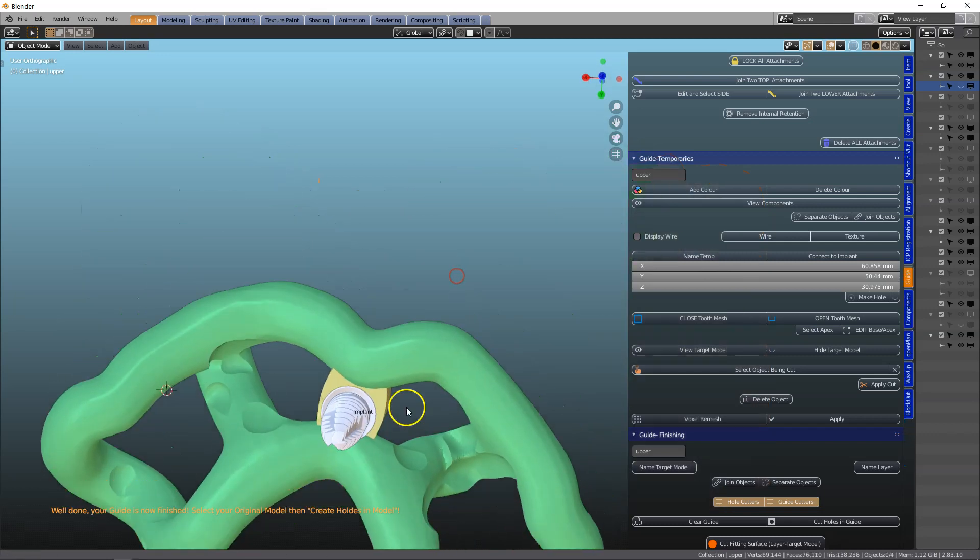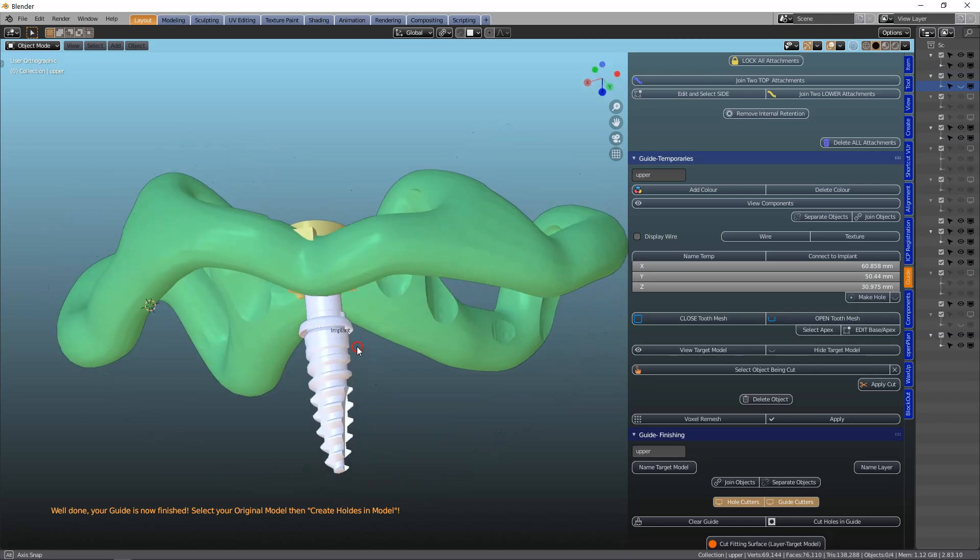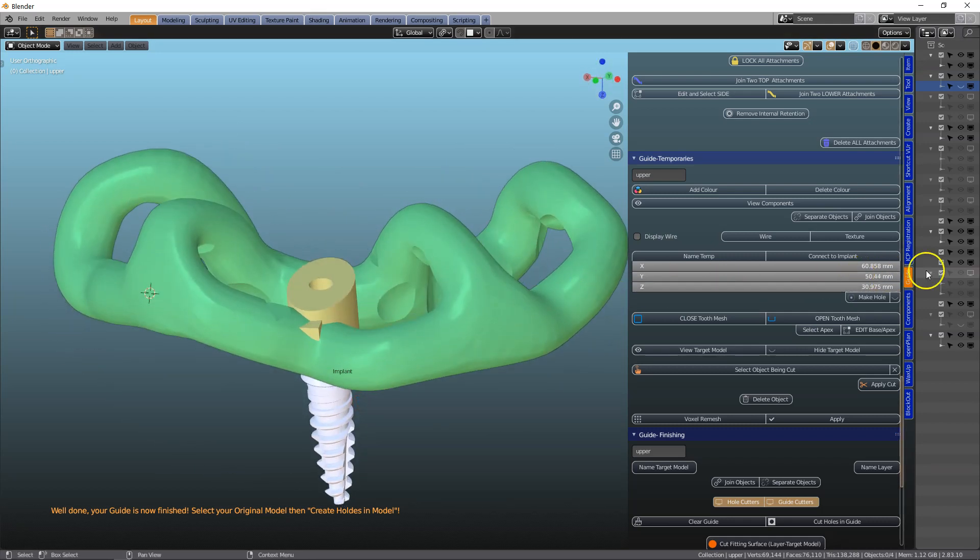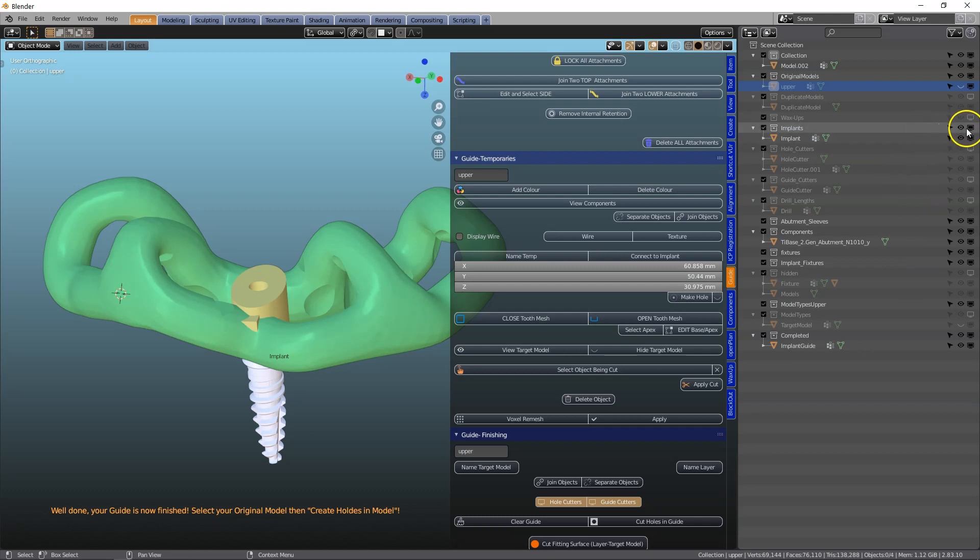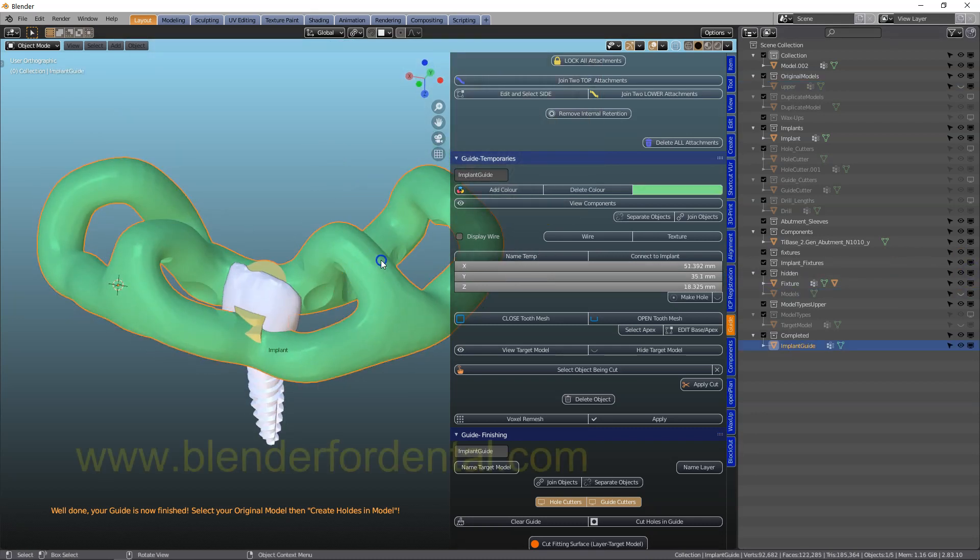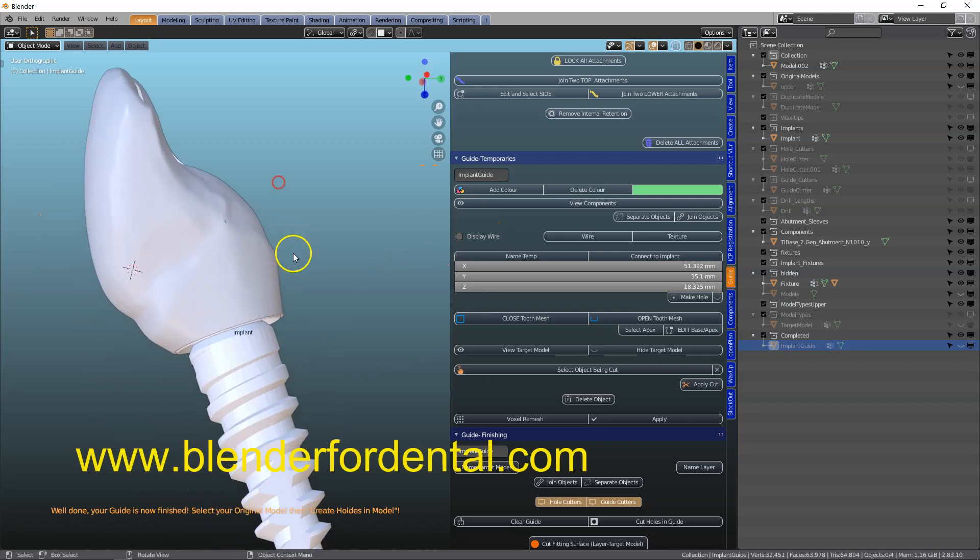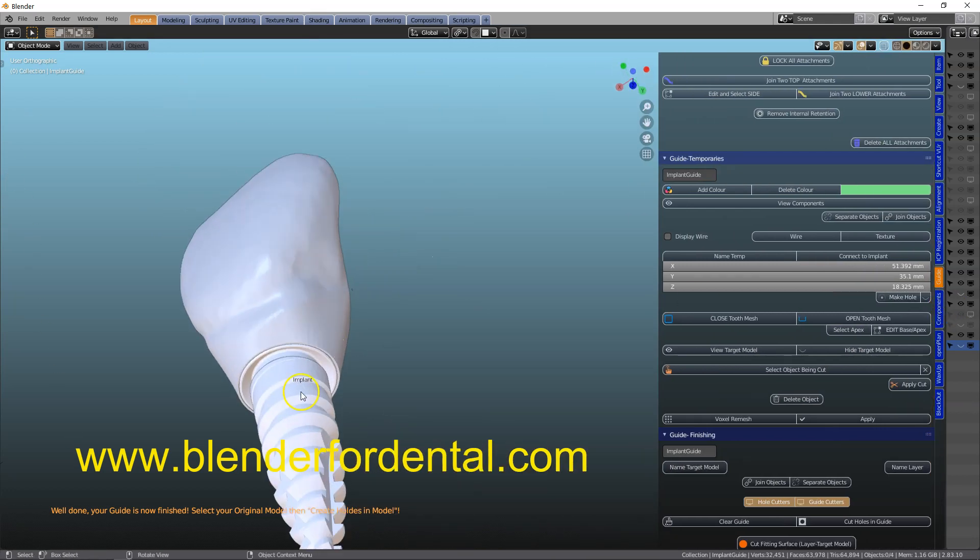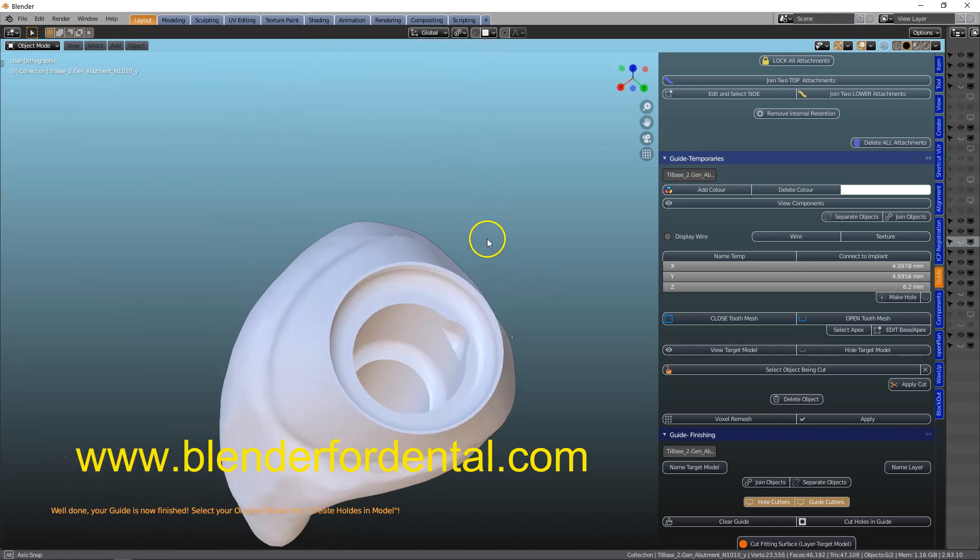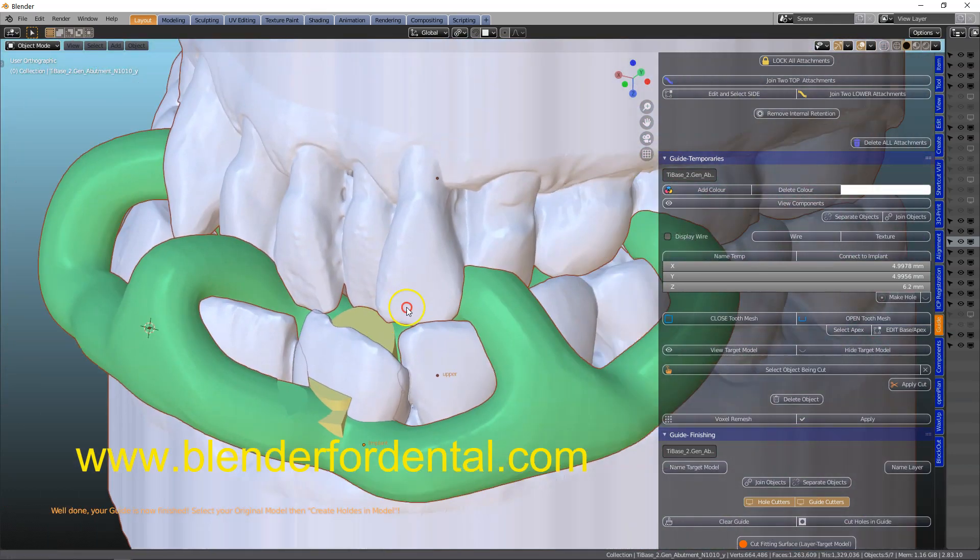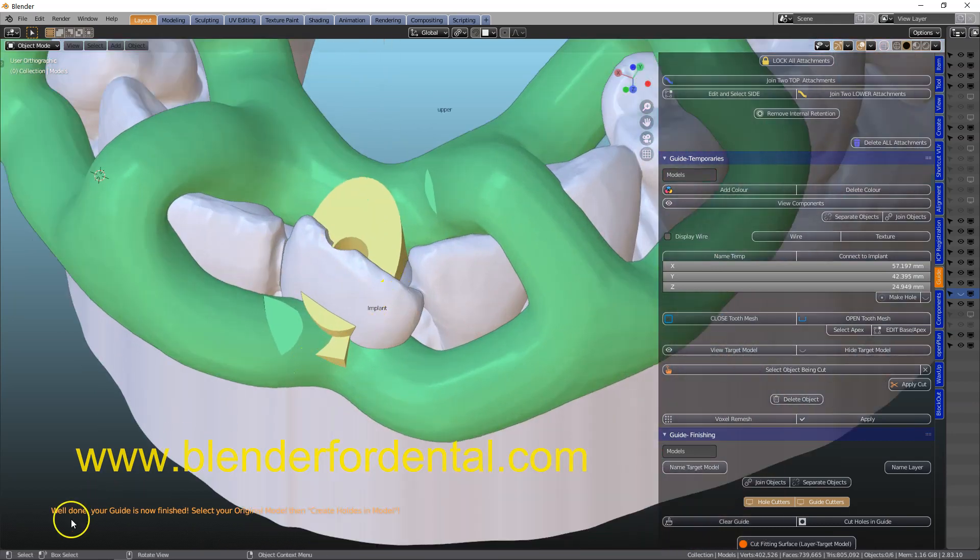Let's hide everything. This is our implant guide. And let us view our crown. This is our crown. It fits where you need.